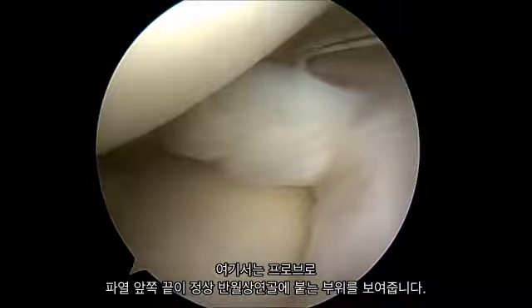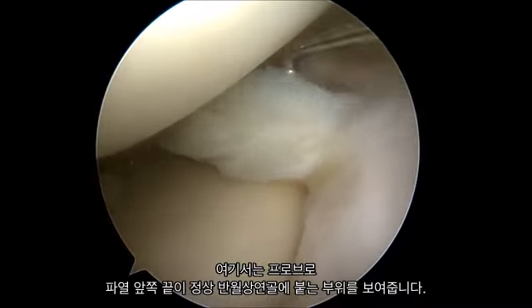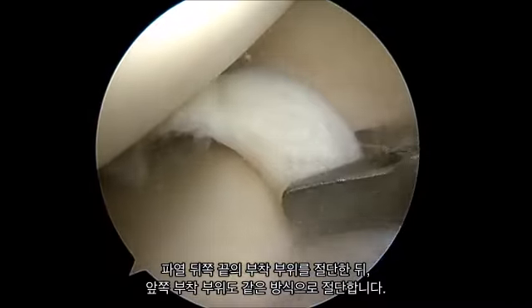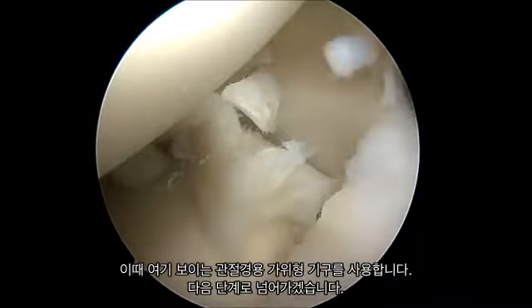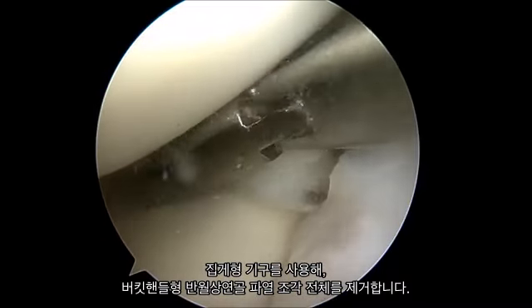Here, a probe shows the attachment site at the front edge of the tear where it inserts onto the normal meniscus. After the attachment site at the back edge of the tear is cut, the front attachment site is then cut in a similar fashion using an arthroscopic scissor type device seen here. Next, a grasping device is used to remove the entire bucket handle meniscal tear fragment.